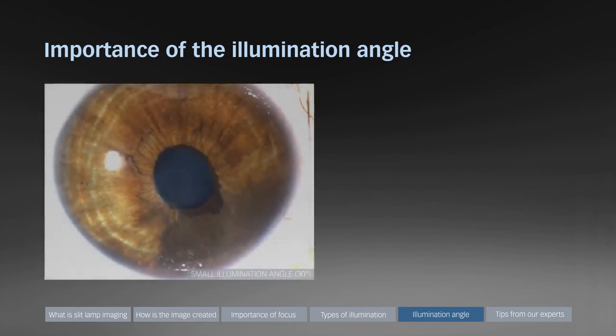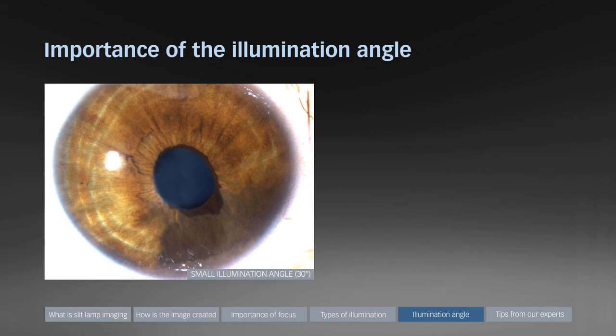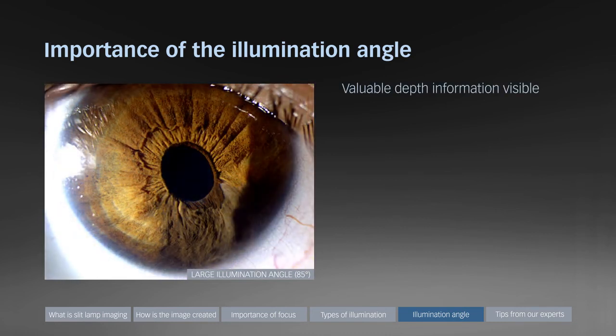This image has been captured with a small illumination angle of about 30 degrees between microscope and illumination. It nicely shows the color of the iris, but it does not give any depth information. The same eye has been captured with a large illumination angle of 85 degrees. Now the shadow casting exposes 3D information of the tumor.